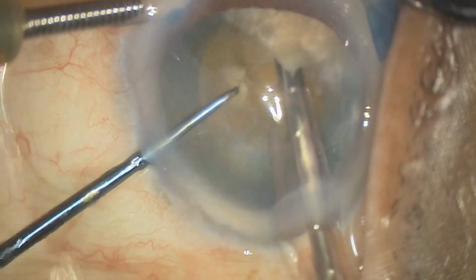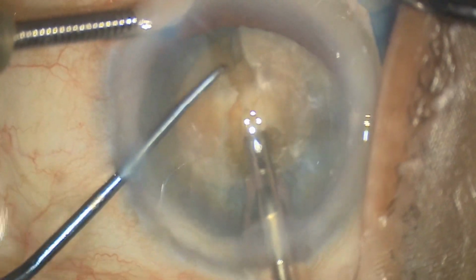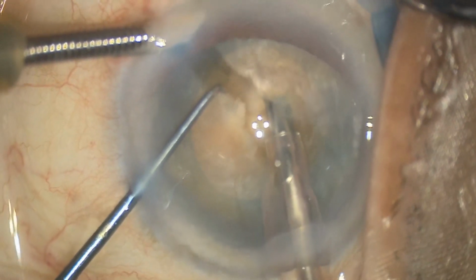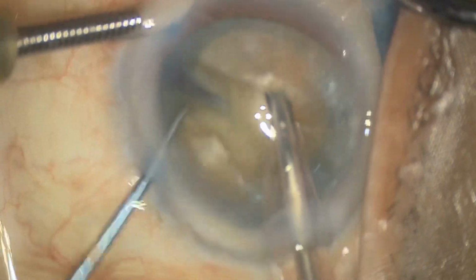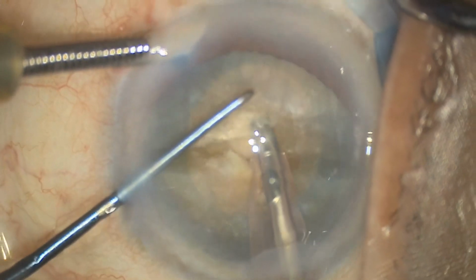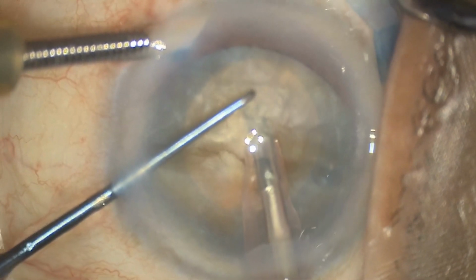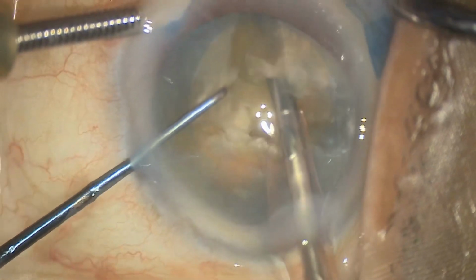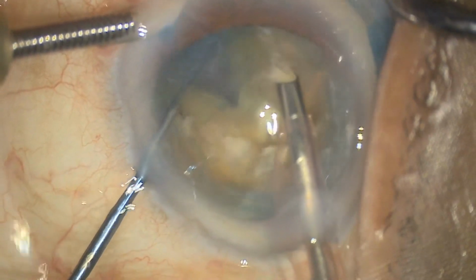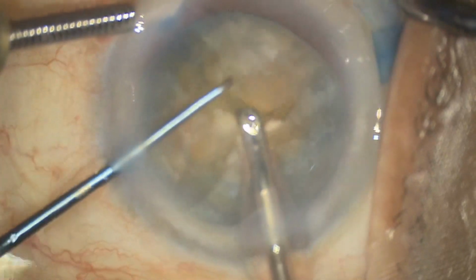The crack is created only by mechanical force, and the lateral separation is also by mechanical force. There is no use of any ultrasonic energy. The only time I use phaco energy is when I bury the phaco tip, where I use a short burst of phaco power. So this is the most efficient way to minimize the phaco energy.